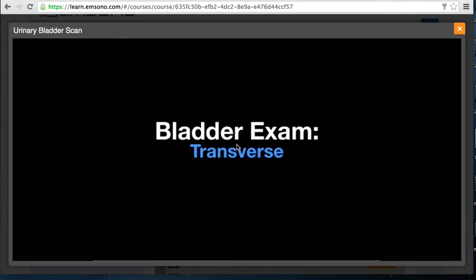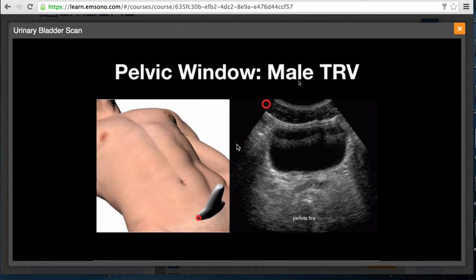For the transverse view of the urinary bladder, the indicator is toward the patient's right, giving orientation of anterior, posterior, patient's right, and patient's left. This provides a nice view of the urinary bladder from which you can obtain AP measurements as well as transverse width measurements. You can also see the bow-tie appearance of the seminal vesicles posterior to the urinary bladder in the male patient.